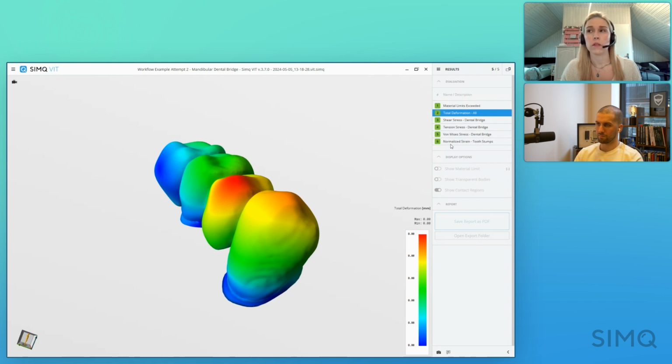But also, we do a lot with simulation. Also, virtual patient cohorts. So maybe like the digital twin. So trying to eliminate or to improve time, money, and resources when it comes to clinical studies testing. And so I'm hoping with simulation it's going to be kind of in the regulatory process.